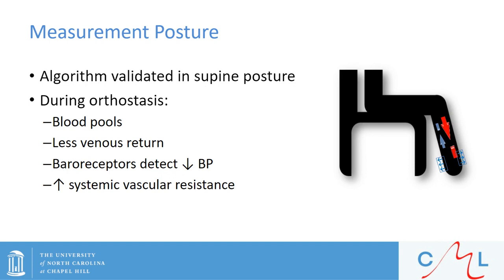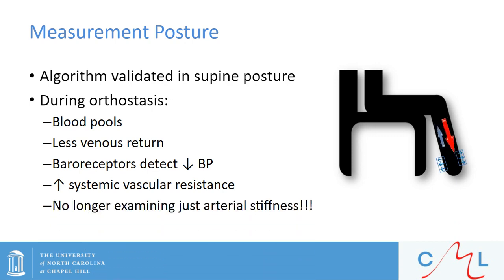As an example of a measurement consideration and our desire to prioritize accuracy, our lab often investigates the effects of sedentary behavior exposure on the cardiovascular system. But how do we measure arterial stiffness or pulse wave velocity in the sitting position or in response to an acute bout of sedentary behavior? If we measure while seated, there is some orthostasis occurring, which is leading to additional, potentially confounding physiological effects. So are we truly still examining arterial stiffness? Likely not. This is just a simple example showing some of the confounding measurement issues that we face with the pulse wave velocity measure.